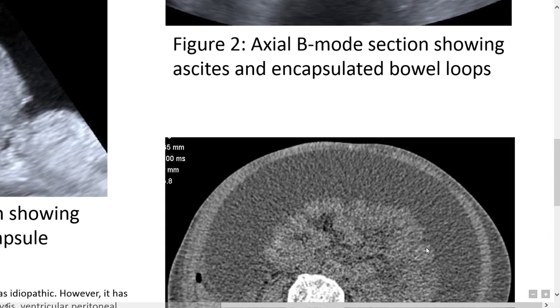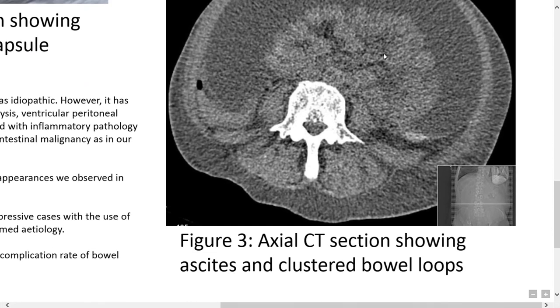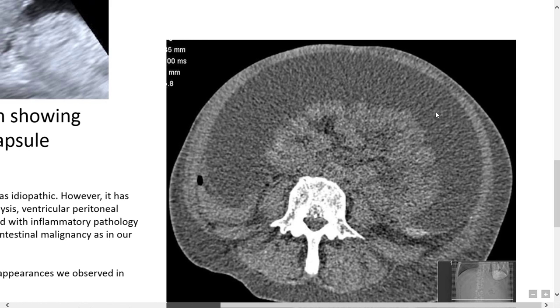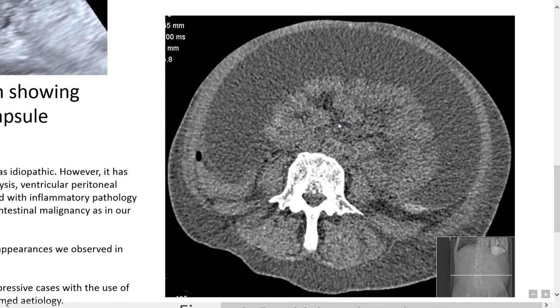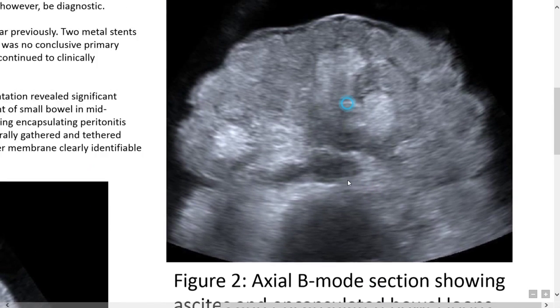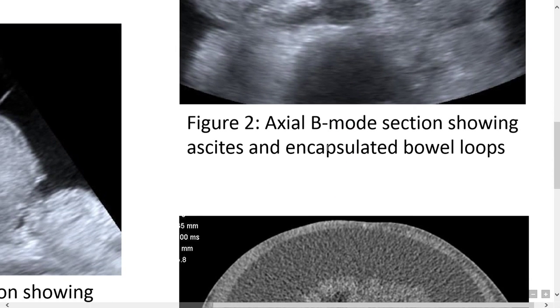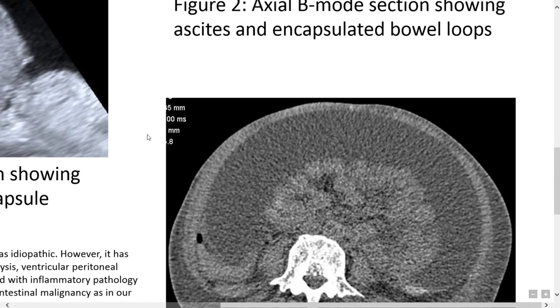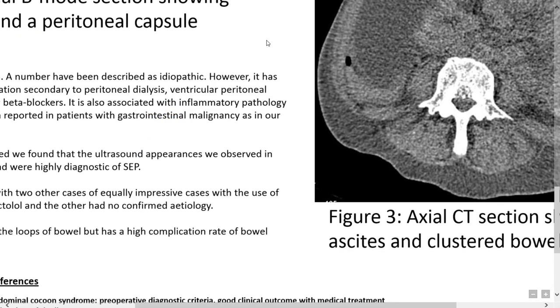The outer membrane clearly identifiable on ultrasound was not detectable on CT. Here we have Figure 3: an axial CT section showing ascites and those clustered loops of bowel in the mid to lower abdomen. Where on ultrasound we clearly see the distinction of fluid, membrane, fluid, and then small bowel loops, this appearance is less easy to identify on CT.